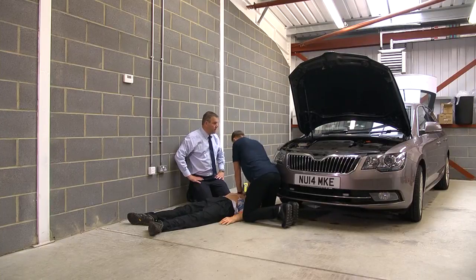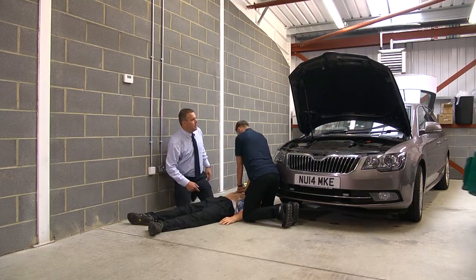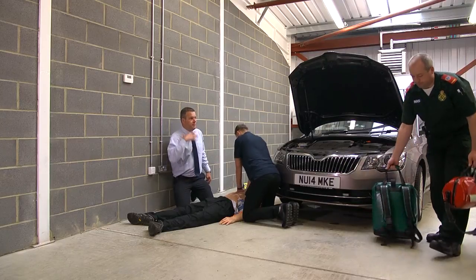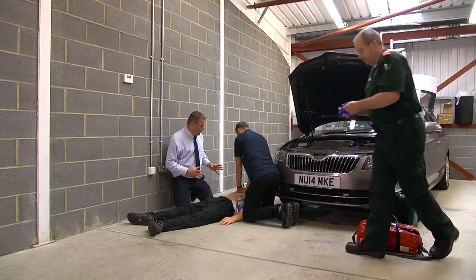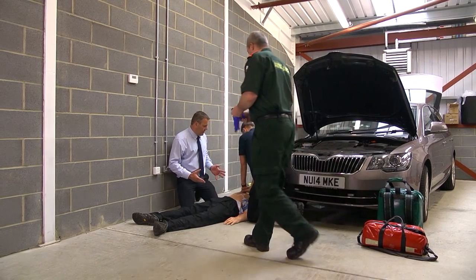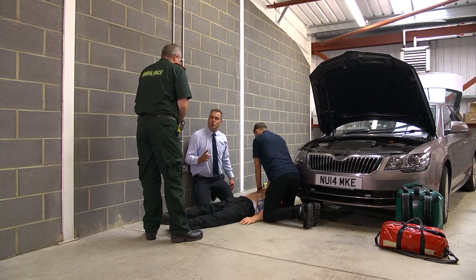Hello, ambulance service. Oh, over here. Hiya. Yeah. Hello there. This is Greg. Hiya, I'm Steve. Yeah, I'm Jamie from over the office. Hello there, what's happened? So, Greg's collapsed. We don't know why, but he's obviously in cardiac arrest. We've started CPR. I got the defib from the office. Excellent. And we've given him one shock so far.